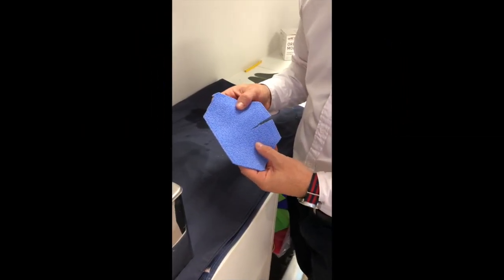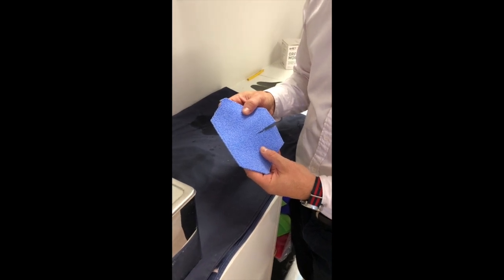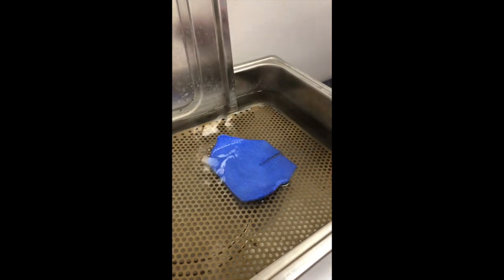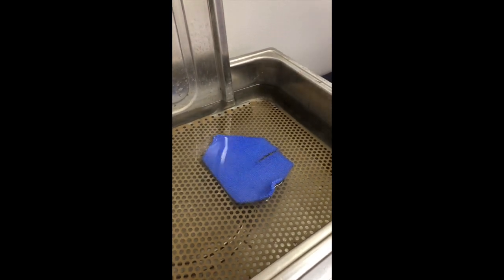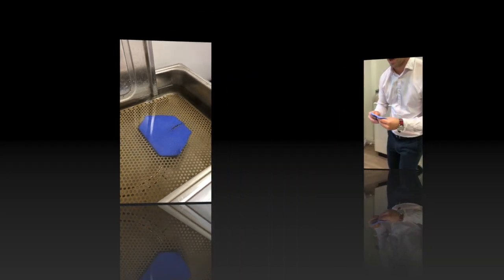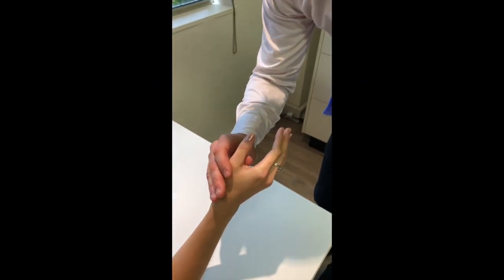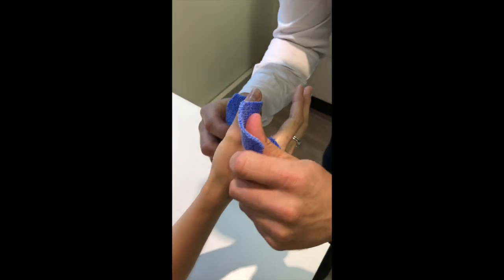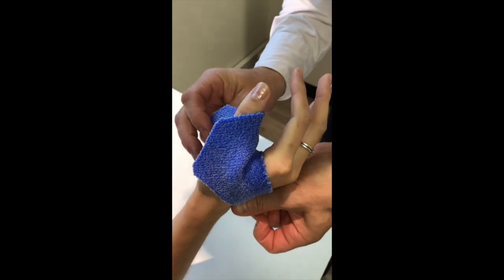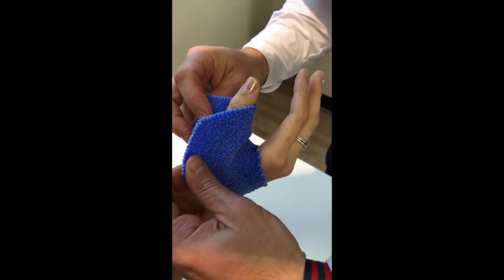What you'll notice with the Orphicast product is that when you put it into the water, it shrinks the product to our patient. Always make sure that your patient is set up in the position first — you don't want to be doing that while you're handling hot thermoplastic.